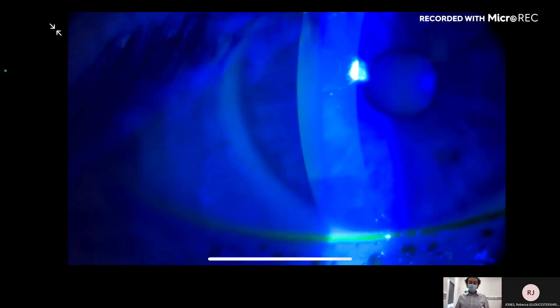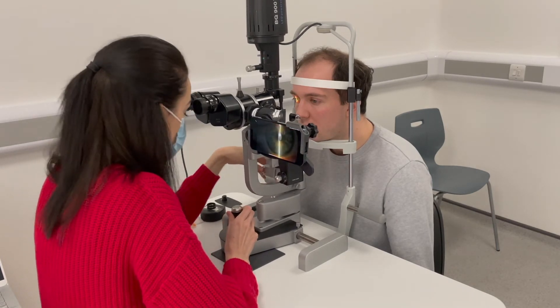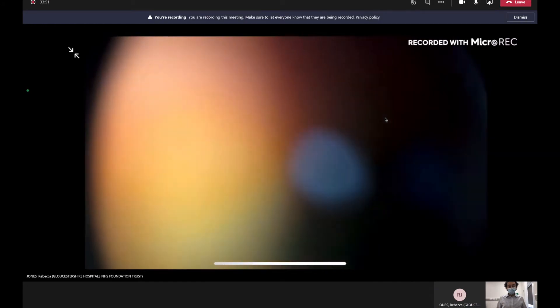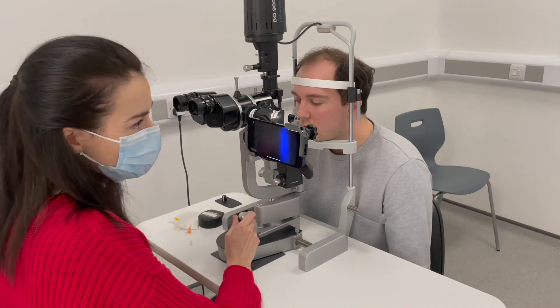I think somebody will need to do some lid hygiene. Should we have a look at the back? It is a small pupil, but hopefully we should still be able to have a look. Well, that's a really clear view there. That nerve looks quite healthy with clear margins — maybe some drusen changes, but it definitely doesn't look swollen. No, I'm happy. That looks like it's got good clear margins and there's no obvious swelling, so I'm happy. I think you're right — it is more likely to just be ocular surface rather than anything nasty going on. That's been really helpful.